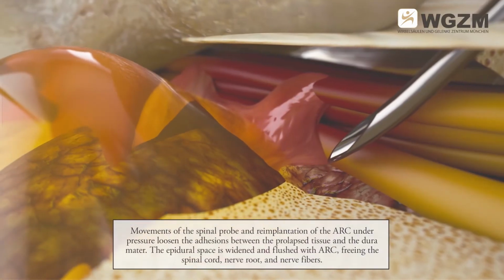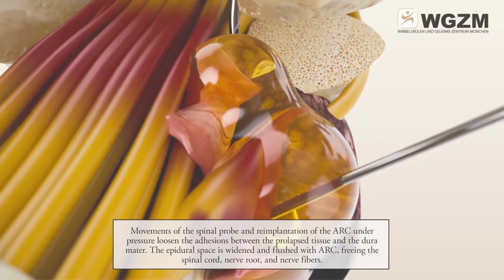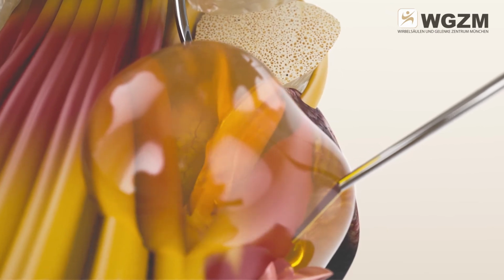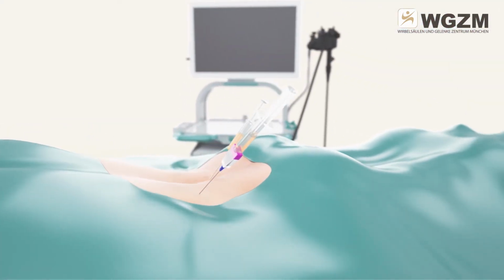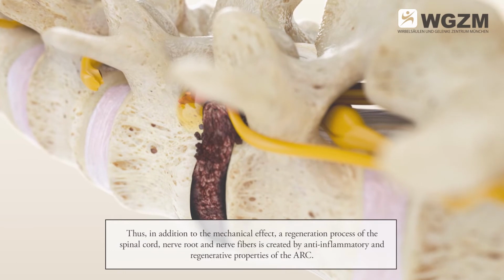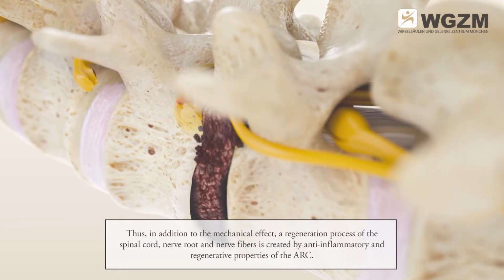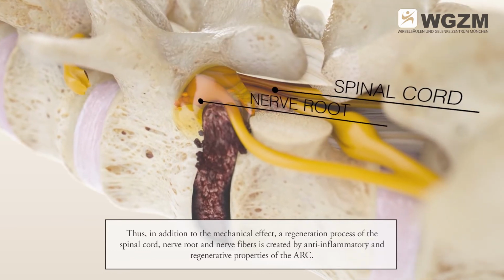The epidural space is widened and flushed with ARC, freeing the spinal cord, nerve root, and nerve fibers. Thus, in addition to the mechanical effect, a regeneration process of the spinal cord, nerve root and nerve fibers is created by anti-inflammatory and regenerative properties of the ARC.